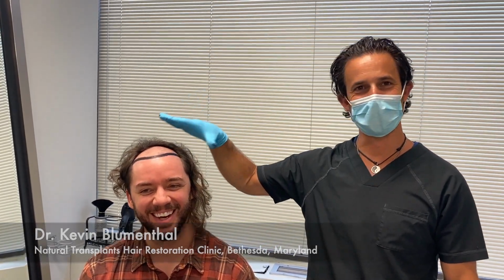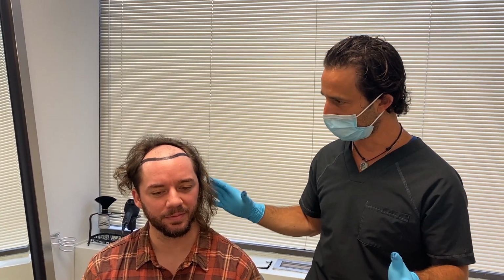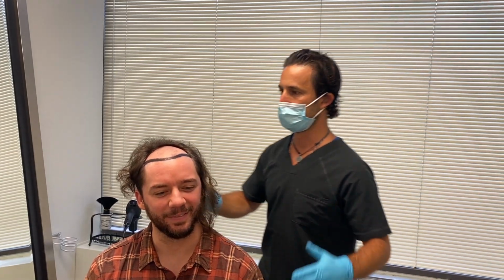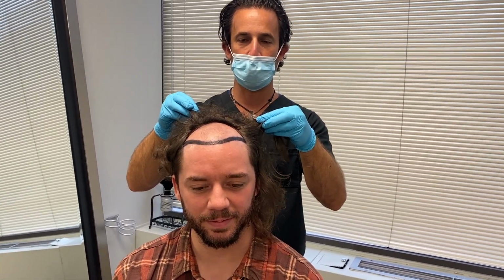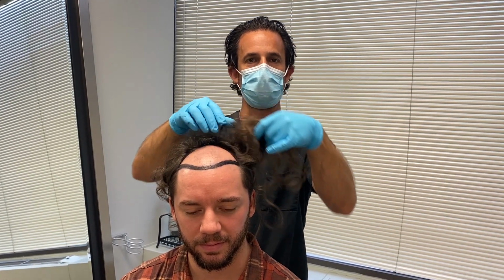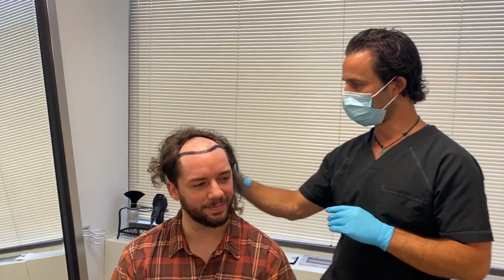All right, we are back with Luke, and Luke, unfortunately, we got an embarrassing haircut right now, but as we've done some shaving here, this won't be a long video, I promise you. We've done some shaving, we've drawn out the line. I think it's a nice natural look on you. It's not doing too much, but still making a big improvement. The hair that we swept back, we're going to fill in the frontal third. He grew his hair out in a way where after 4 days when he can start covering it, he can still sweep the hair over and cover it. That's the way he preferred to do it, which is great. We've shaved the back as well.